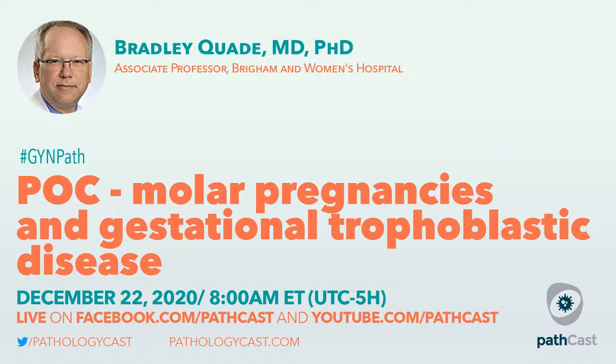We've all been looking at other possibilities, like, in the adults, one of the patterns that seems to be important is microvascular thrombosis. And we've done a bunch of stains for cases of stem villus thrombosis and chorionic vessel thrombosis. That doesn't seem to be viral. Virus isn't present in those. And we stained a lot of chronic villitises and haven't had any success, or even early infarct-like things. I've stained a bunch of those just to see.